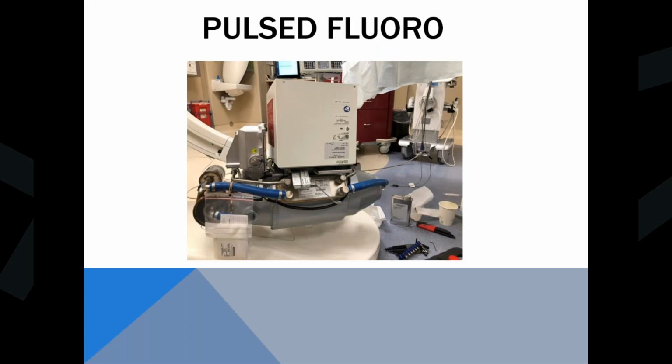What the pulsed fluoro does is it synchronizes the X-ray to the camera or detector, depending on what system you have. The advantage of that is that it cuts the jitter out. So if you're making a 30 frame per second exposure, this will only make X-ray every time you want to frame, and it synchronizes the X-ray with the camera. Some of the earlier systems kind of looked out of focus and jittery. Using pulsed fluoro synchronizes the two together, and then you get a nice, smooth, clean image. So this is where the difference between conventional rad and fluoro comes in.